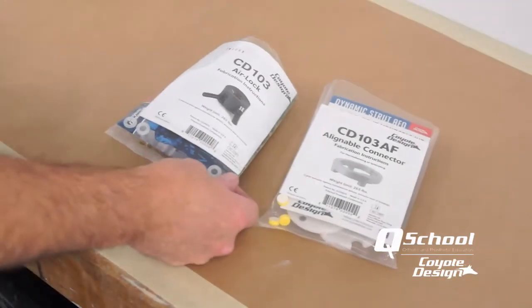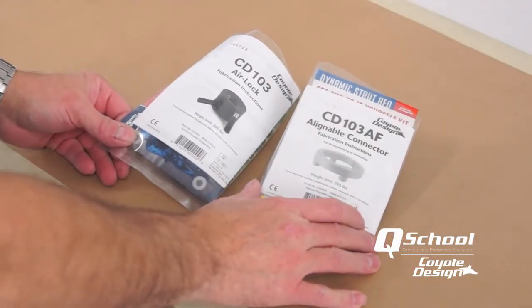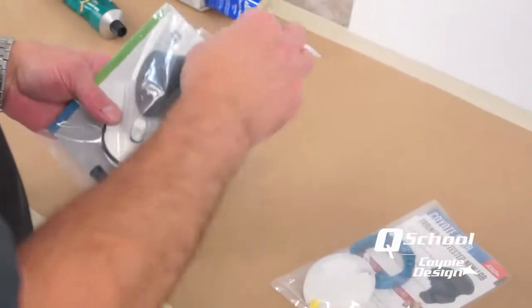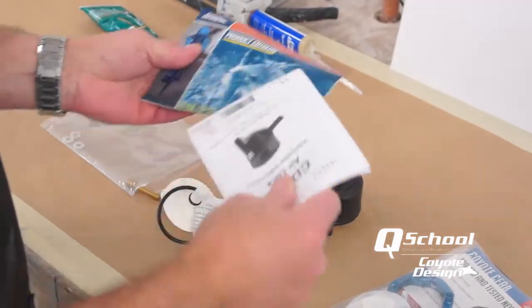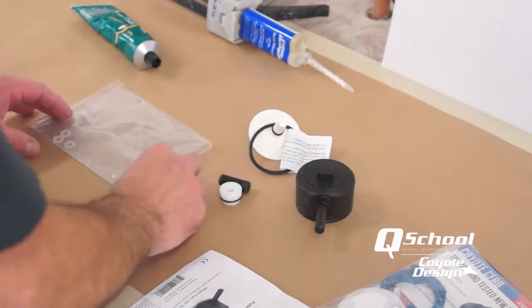We are going to laminate a CD-103 airlock with a CD-103AF alignable connector. This is the package you will receive when you order this — all your components should be in it. Put aside the things we don't need and keep the things that we will.